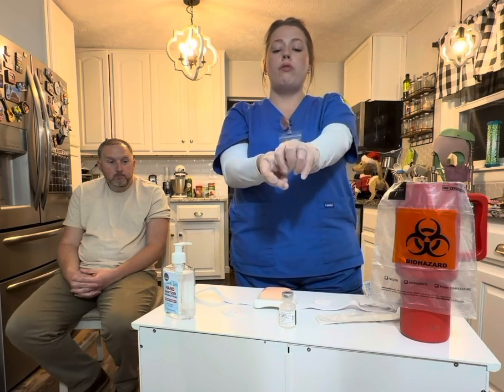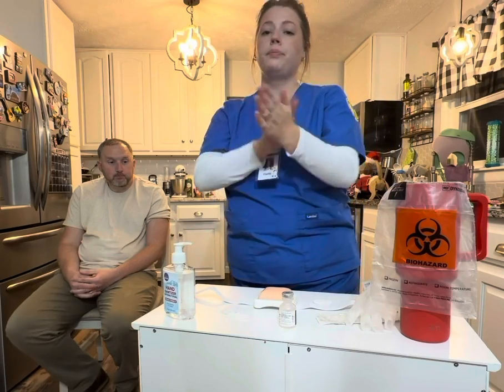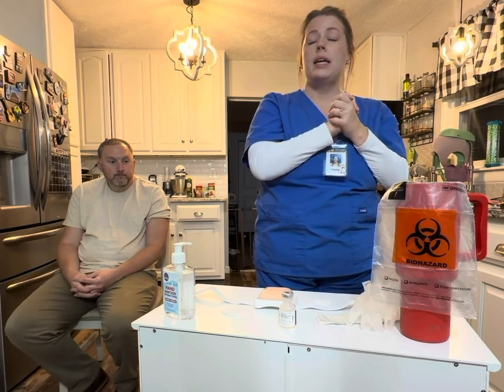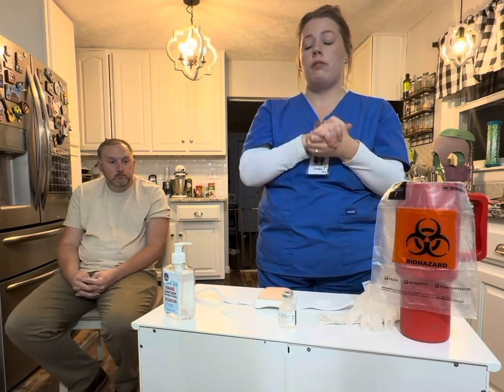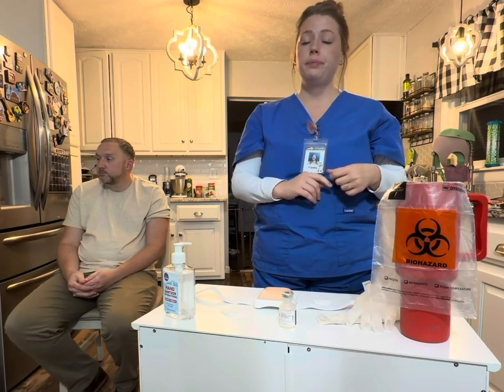Then we would remove our gloves, perform hand hygiene, and then we're going to make sure that we immediately document everything that we did, our injection site. And then we're going to make sure that we come back and evaluate our patient for any kind of adverse effects, see how they're doing, and make sure they have no redness, irritation, or any concerns.